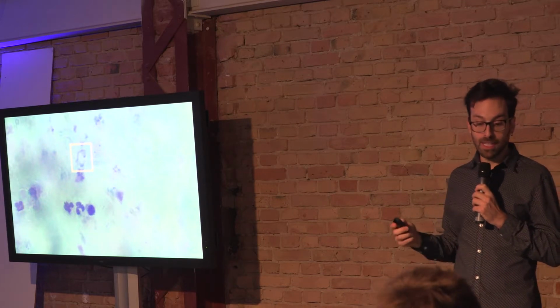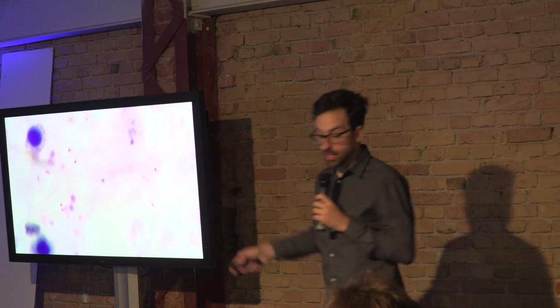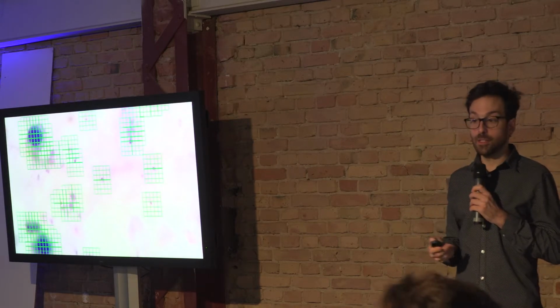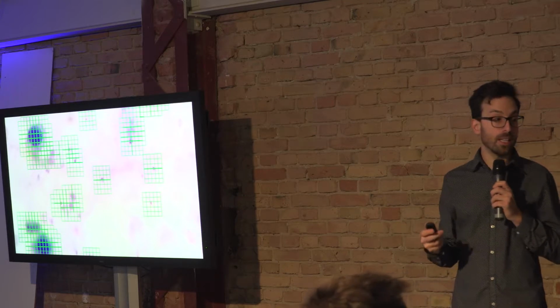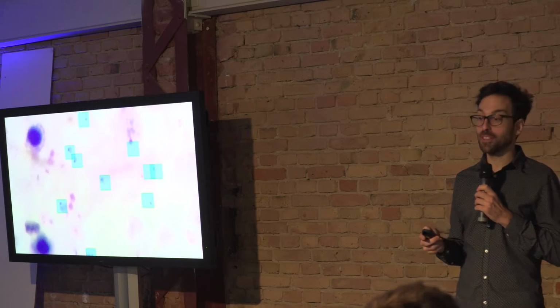So this one here was easy. There's a sample of blood with malaria. All those dots here are parasites. Here in the middle, you can see them, and they are a bit dark. So what I thought first was, let's focus on the dark areas and test my model there. It was so easy. You get several different candidates and go for the best one, and boom. At the end, you get the diagnosis. The cool thing is that it works better than doctors.